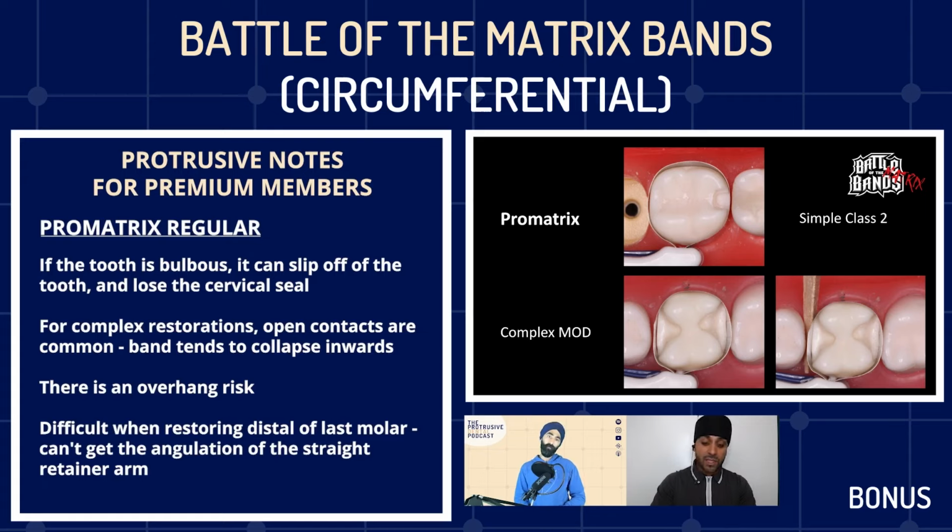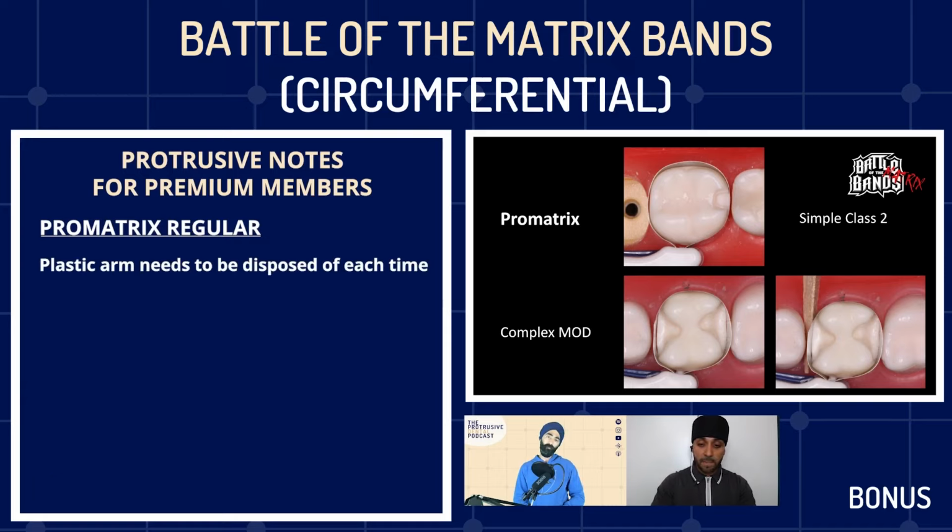And I'd add an additional point to the other, which is relevant for the environmentally minded people, but it's a plastic arm, right? And this whole plastic arm needs to be disposed of each time. Yeah, very valid. No, and it's good you mentioned that.